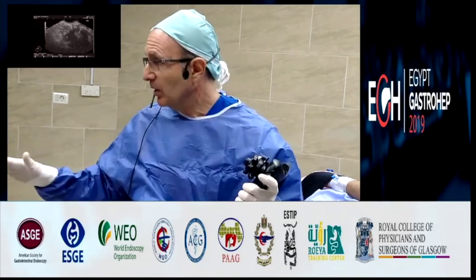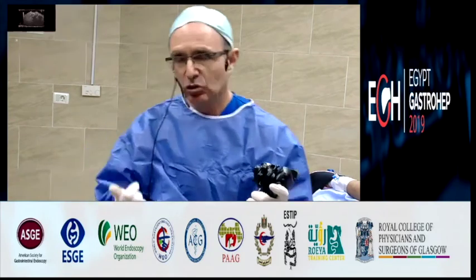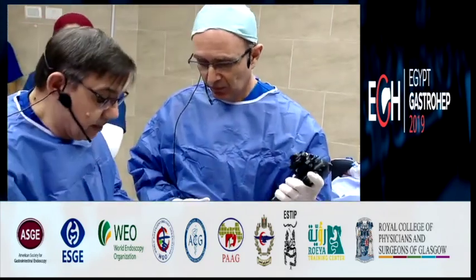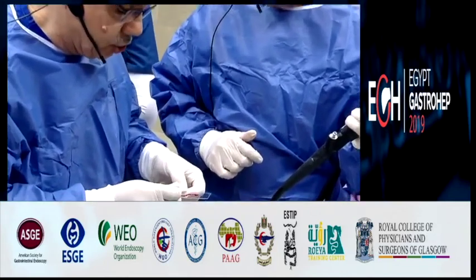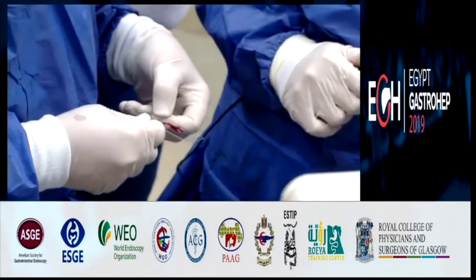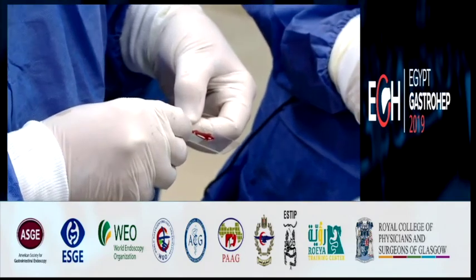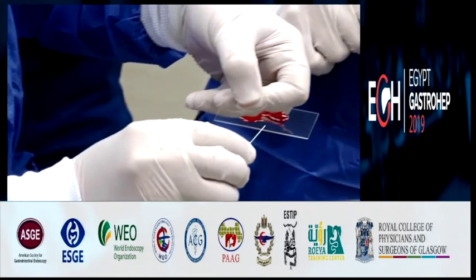Okay, but here you are putting. I don't know if you see. Can we see the specimen? Okay, if you can focus on this. Here you have a very white tissue. You see? I'm sorry, there is a lot of blood. A big specimen. Yes, this. Okay, here, if you can focus.